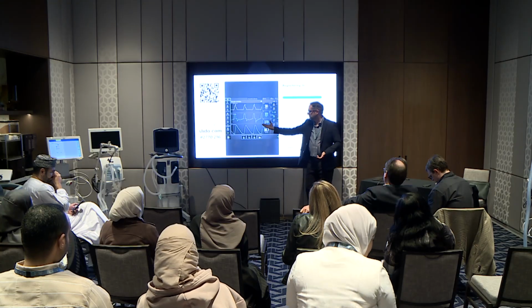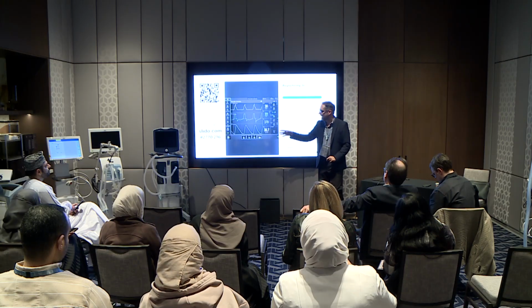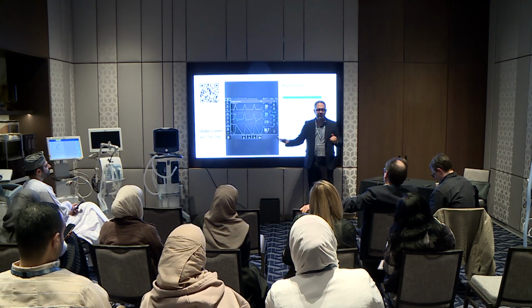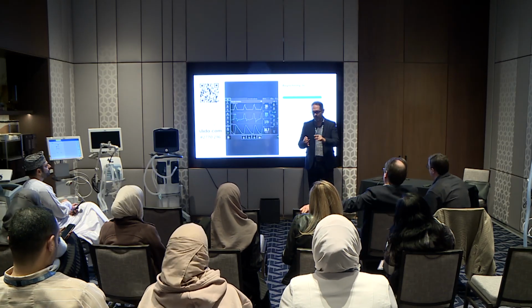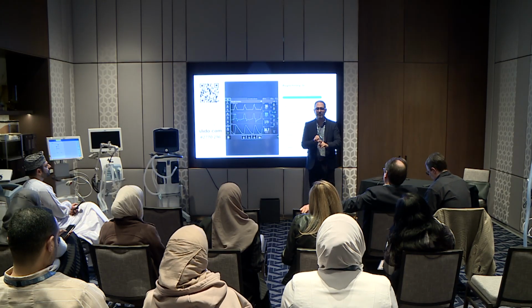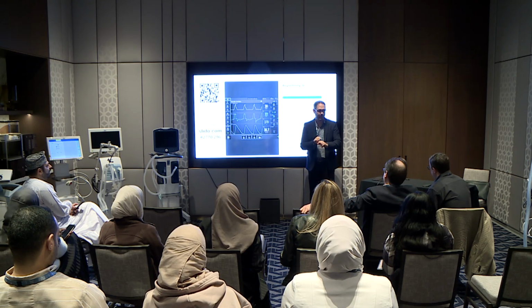Okay, I think I have one more question with this. No, I don't. So what I would not suggest, let's say you try pressure support and they're apneic. So you put them back on here. I would not suggest increasing sedation, decrease it if anything. I would not suggest neuromuscular blocking agents unless the patient is in active, like severe ARDS, I would say, with breath stacking occurring.